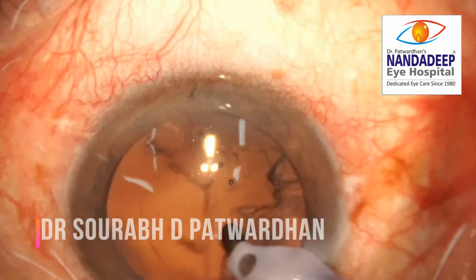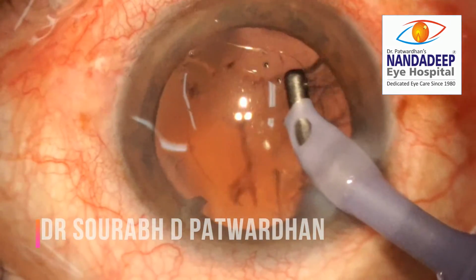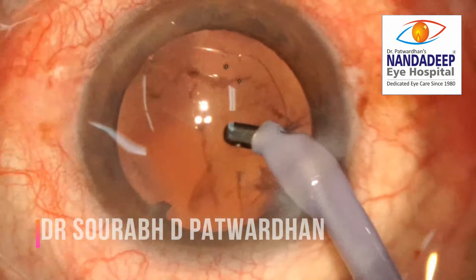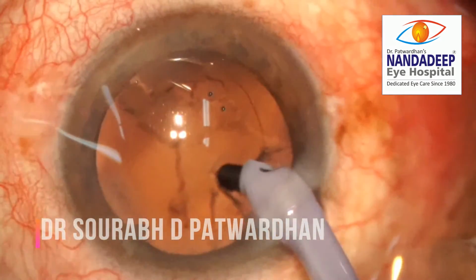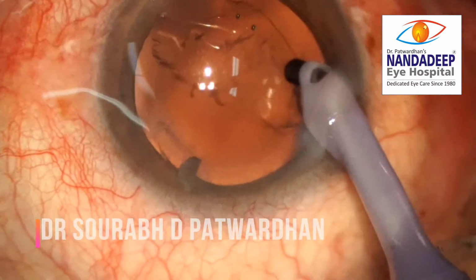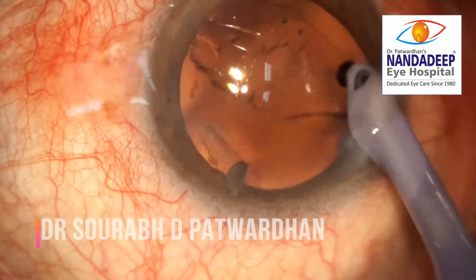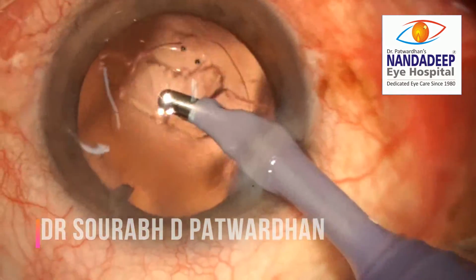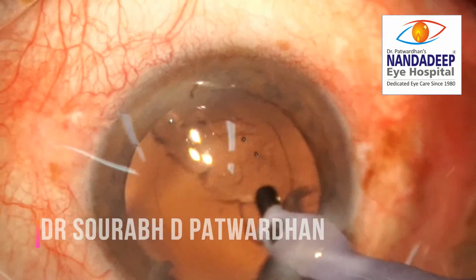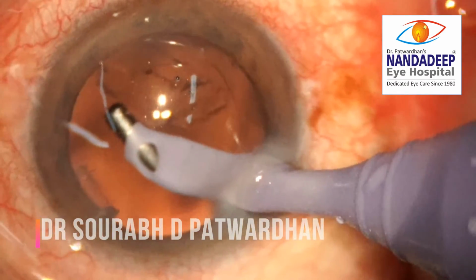As you can see here, once I stop using the side port incision, the AC becomes much more stable. So during your routine surgeries, always keep in mind if the wound leak is high or not. This will help you in reducing complications in many of the cases, because wound leak is one of the causes of surge even with the best of the machines and can cause increased chances of PC rent.